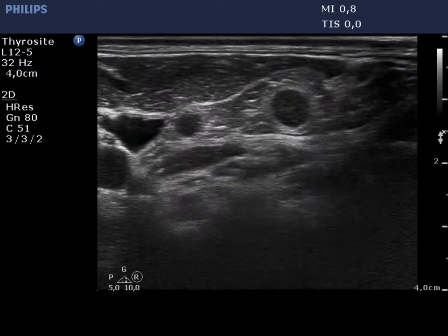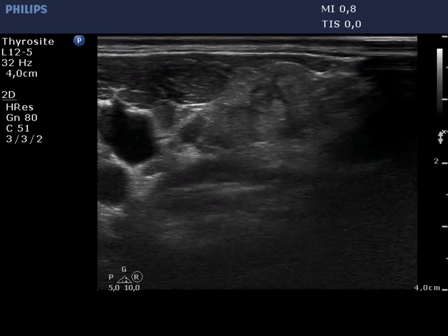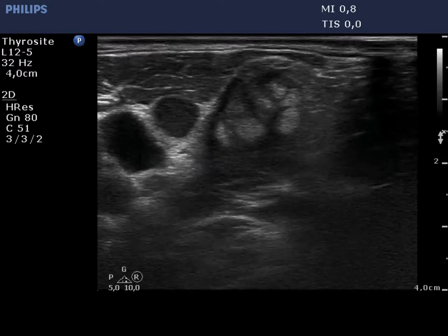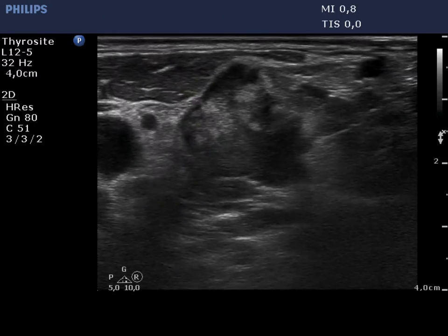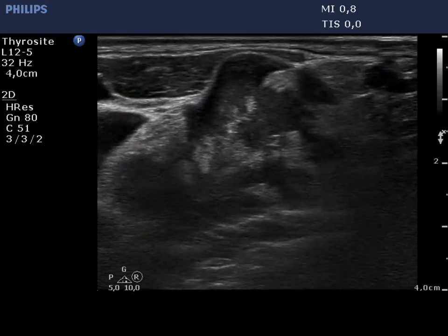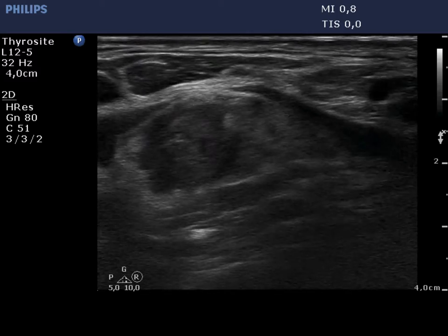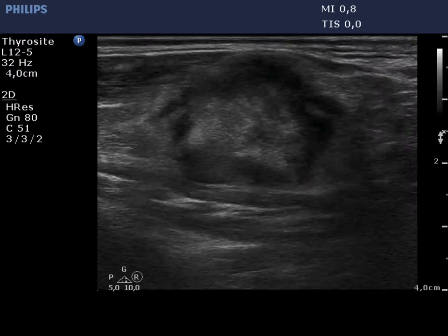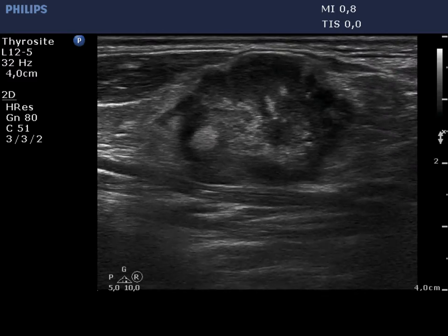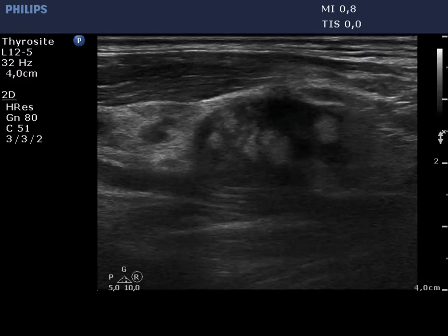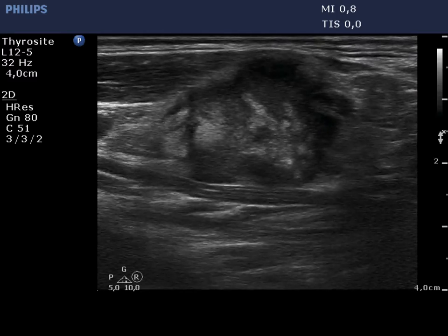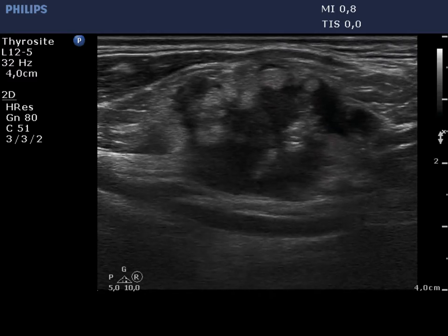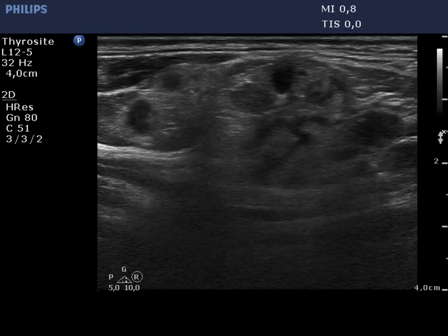Now the supraclavicular region is demonstrated. There are multiple lymph nodes next to each other with a disrupted structure. This ultrasound presentation is practically diagnostic itself for a malignant tumor.